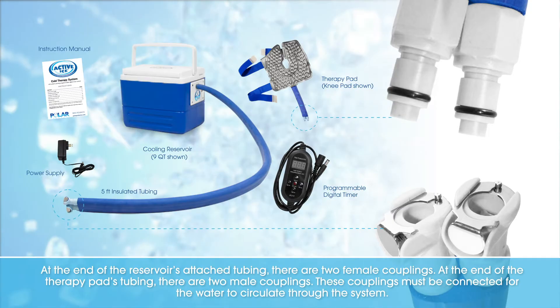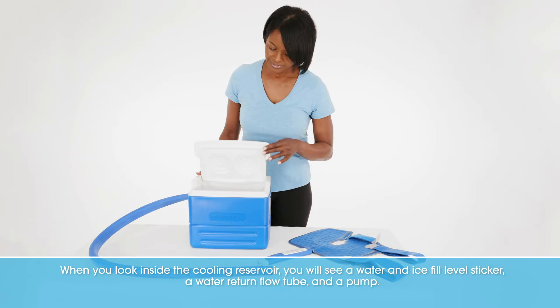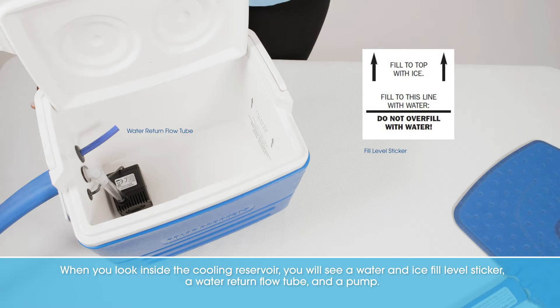These couplings must be connected for the water to circulate through the system. When you look inside the cooling reservoir, you will see a water and ice fill level sticker, a water return flow tube, and a pump.